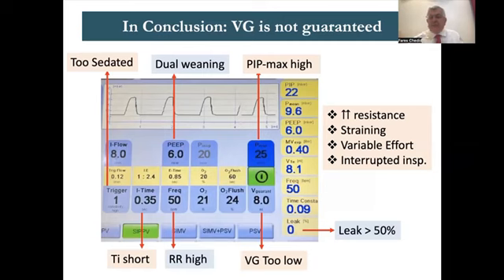So maybe in those patients, at the time when he's totally sleepy and sedated, you check with the volume guarantee what PIP he needs, then you take out the volume guarantee and you set that PIP. So volume guarantee is not for patients who are too active or too chronic. As I showed, interrupted inspiration also sometimes affects the PIP. I hope this was relatively clear.